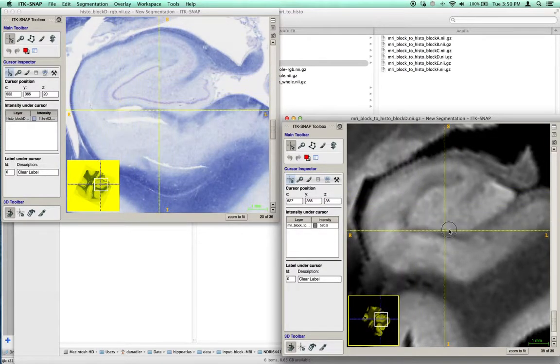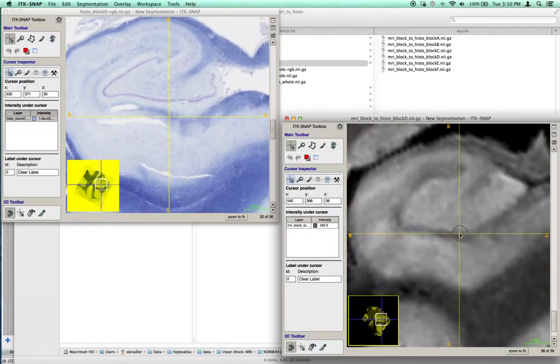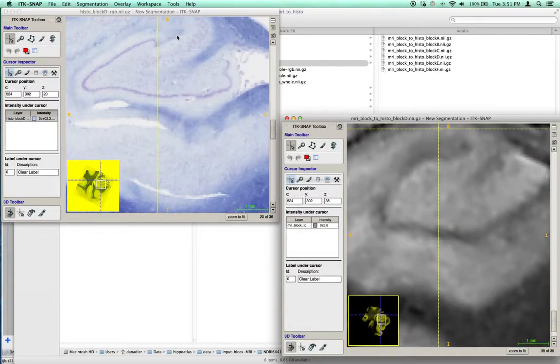And so in theory, you could go through your MRI here, inspect, say, this dark layer, and actually find out what it corresponds to histologically using various immunohistochemical stains. Or you could go here to the pyramidal layer and see exactly what kinds of cells are there.